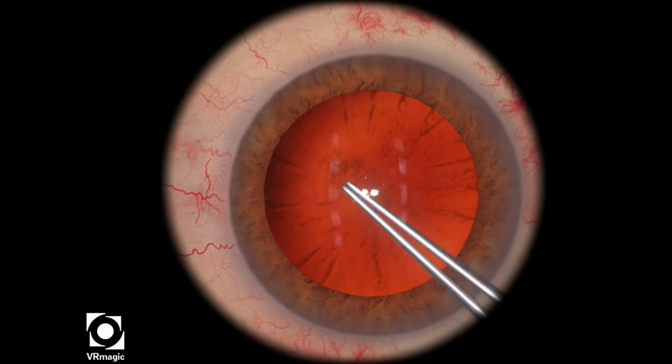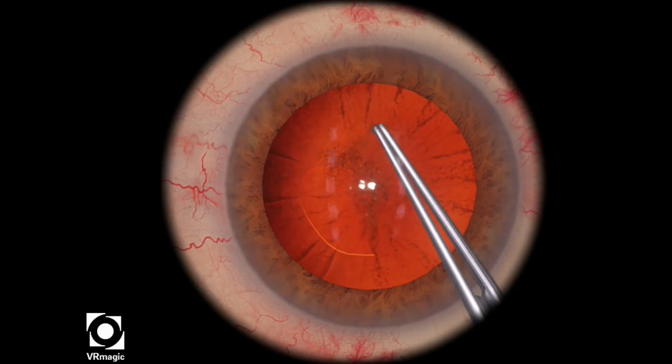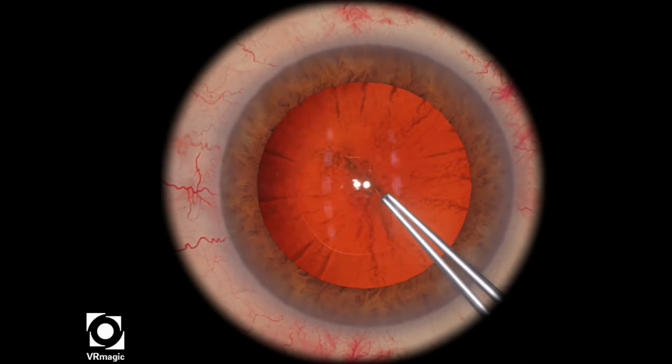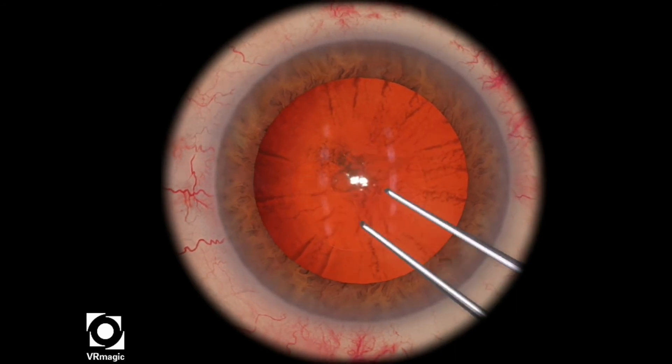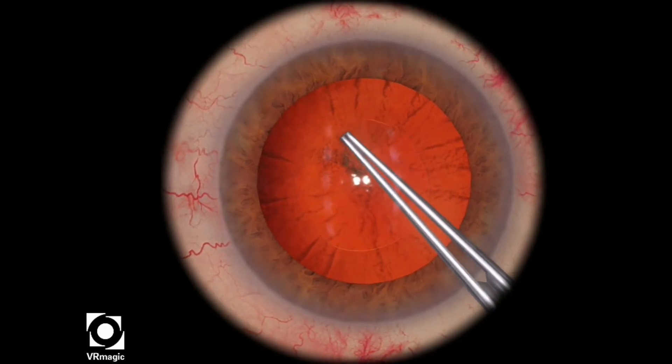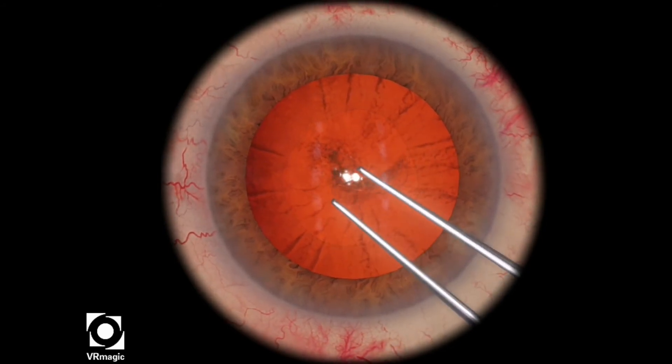Score a backwards 7. Here I've got a bit of the flap there, and then pull towards the center. Remember that it's in high tension. Then continue on with a shearing technique to complete the rest of the rhexis. You want your rhexis to be as round as possible — that's how the simulator scores you.